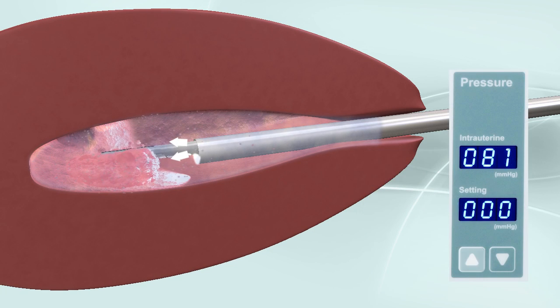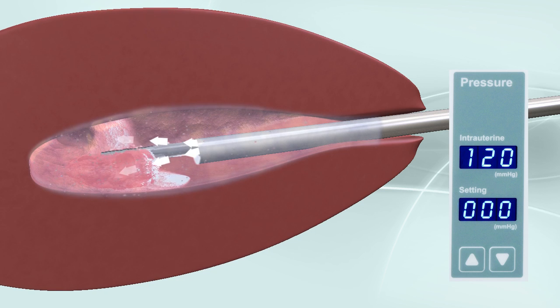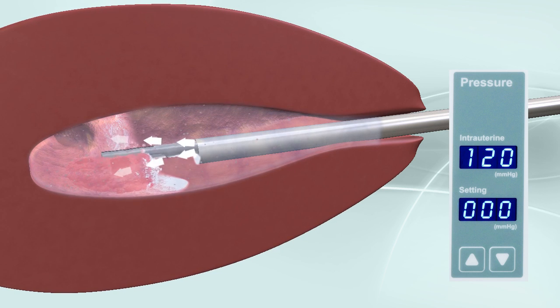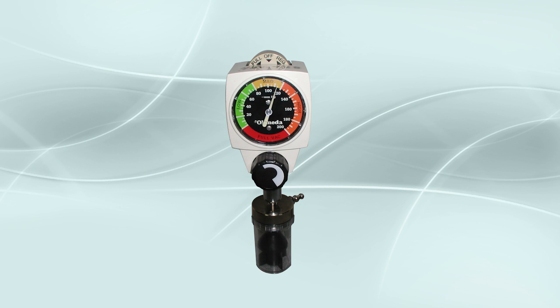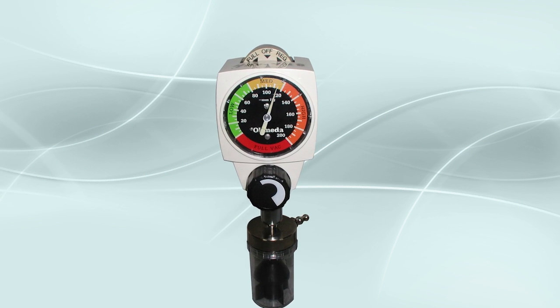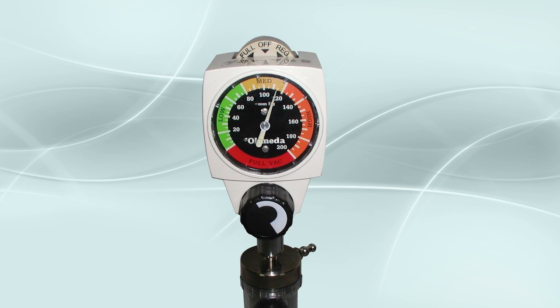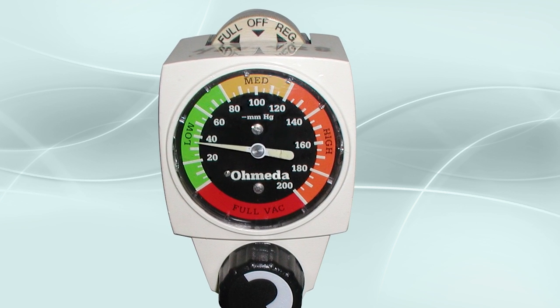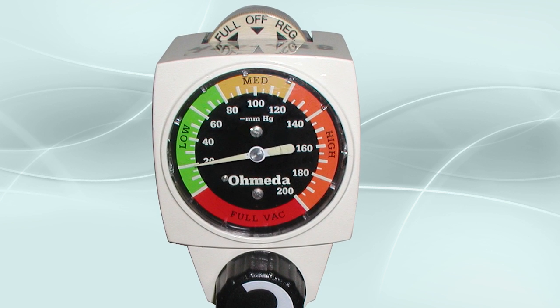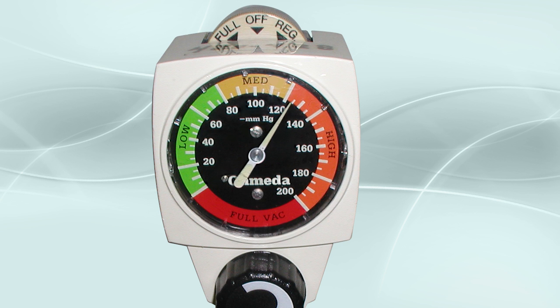This may necessitate periodic adjustments of increased pump pressure to maintain the desired uterine distention. Each fluid pump performs differently, and therefore an adjustable suction source should be used during the Myosure procedure to provide vacuum pressure adjustments based on the inflow performance of the fluid pump used.